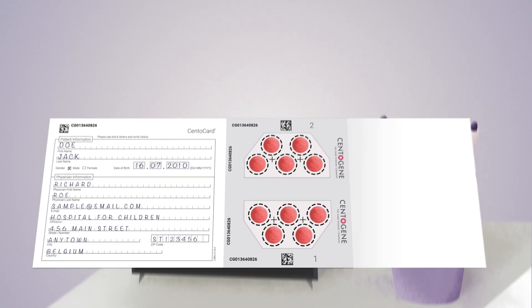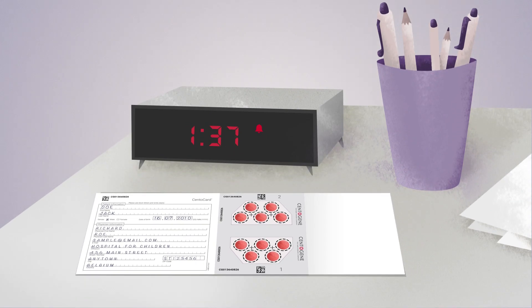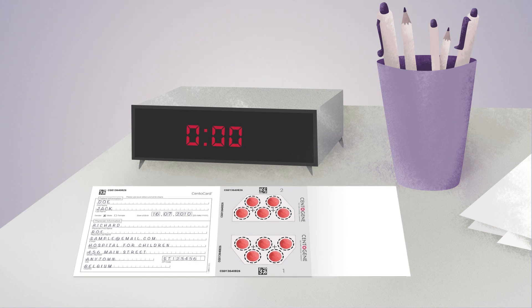Step 3. Allow the filter paper to air dry at room temperature for a minimum of two hours, making sure that the sample is not covered or stacked on top of another during the drying process or refrigerated.